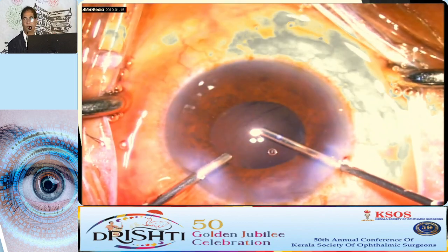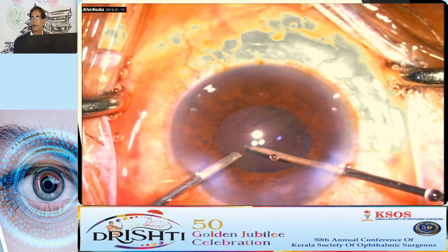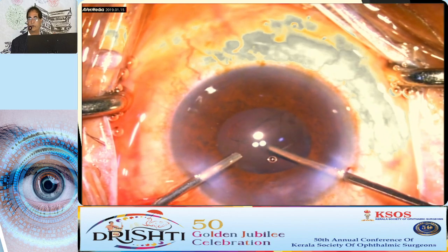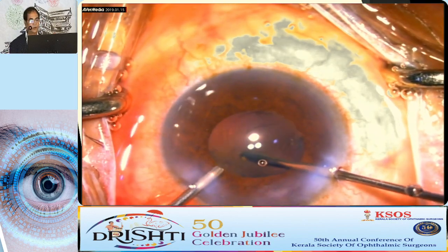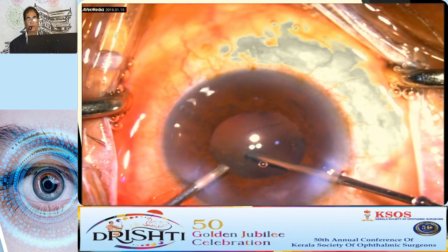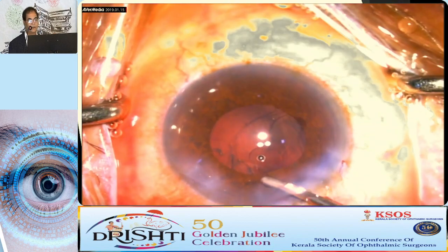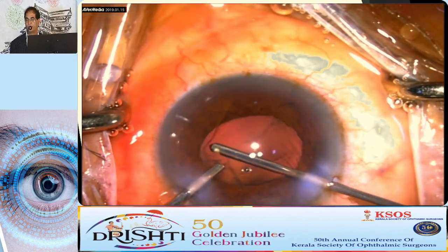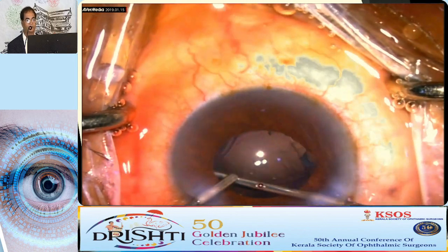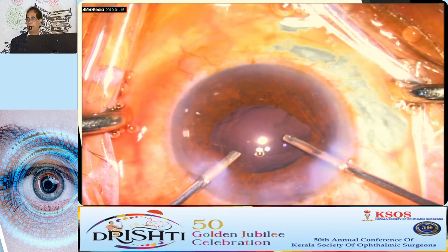Now you have to increase the cut rate to the maximum, whatever cut rate you have initially, because if your cut rate is low, it will drag the vitreous and it will cause inflammation. So maximum cut rate, and once you are thorough with the vitrectomy, you can come back to IA cut. In IA cut, the aspiration will be first, the cut will be second. So this will help you to aspirate the cortex. Now I am in IA cut, I can just aspirate the cortex, bring it, and then I give a cut.